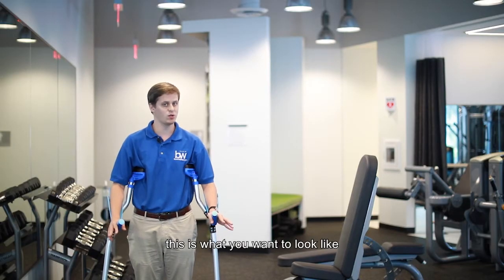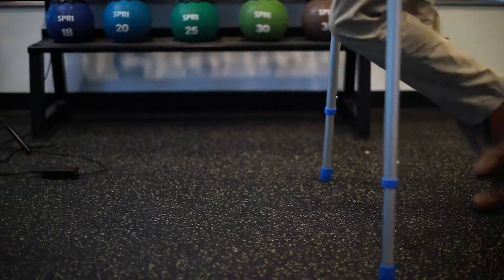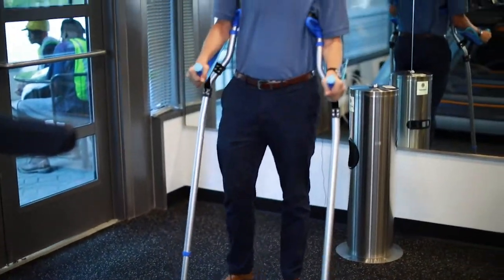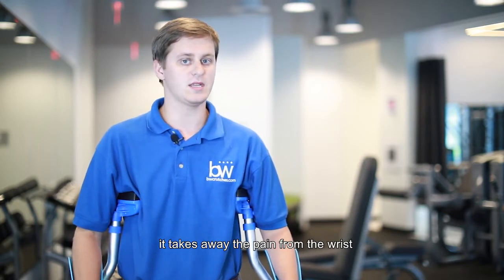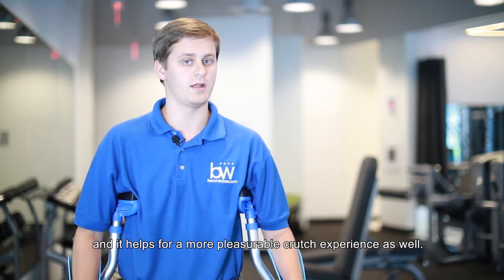So when you're actually using the crutch, this is what you want to look like. Now you'll notice when I'm moving on the crutch that I shift my weight over to the form structure. By shifting my weight over to this form structure, it takes away the pain from the wrist, and it also helps for a more pleasurable crutch experience as well.